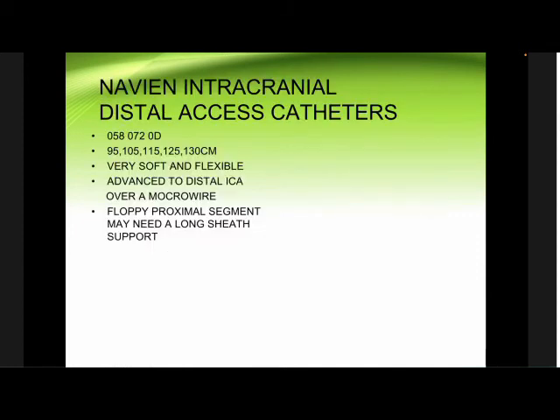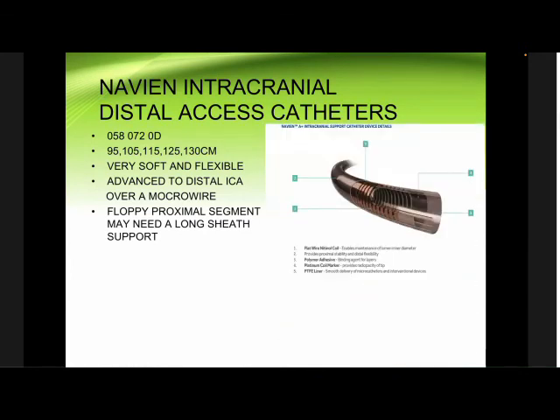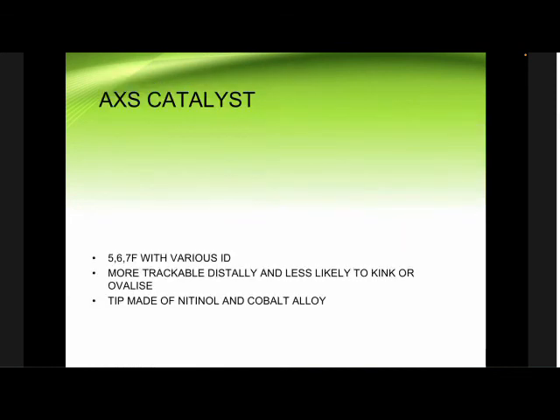The classical distal intracranial catheter is the Navien, and it is made of a nitinol platform, which makes it more flexible and stable, and this flexible proximal segment makes it necessary to use a long sheath for its introduction.